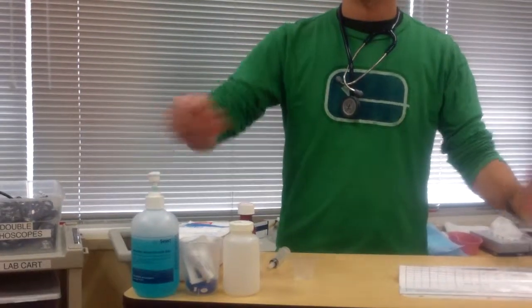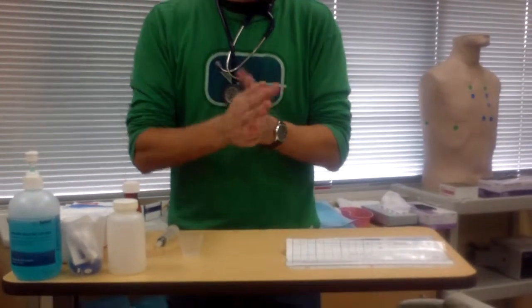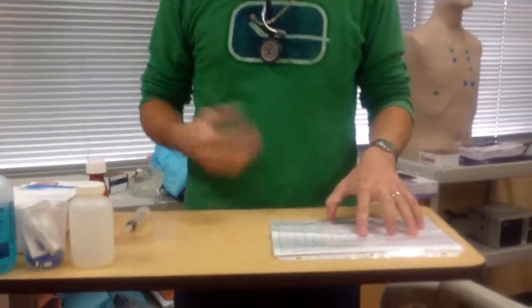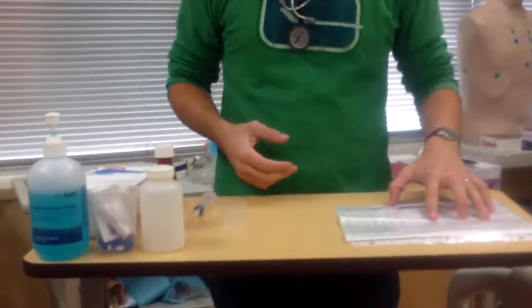So the first thing I want to do is go to my med cart and do a little quick hand hygiene once we get there. And then I'm going to get my MAR and check it. I'm going to see what medication I need. So I know I need Tylenol in liquid form. I'm going to do the first of the 5 checks. In the 5 rights, the right patient, time, route, dose, and medication.